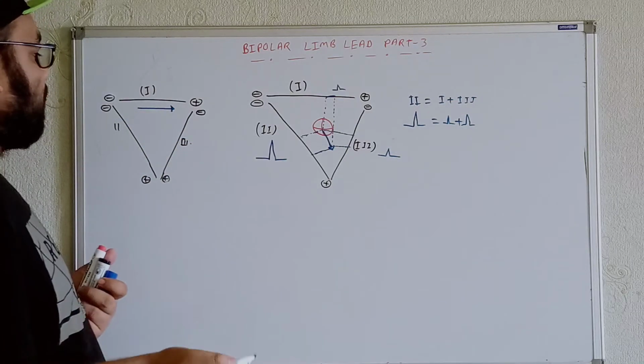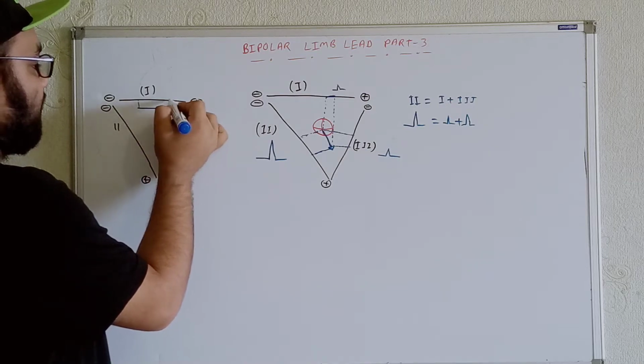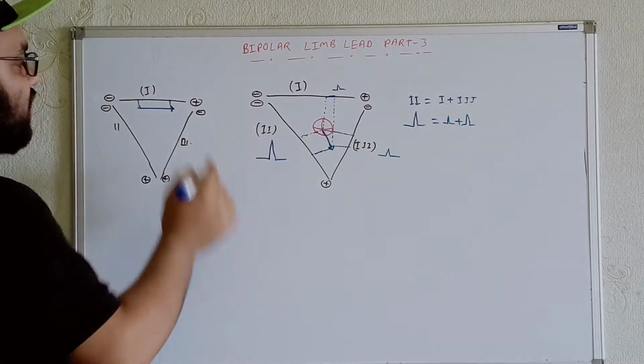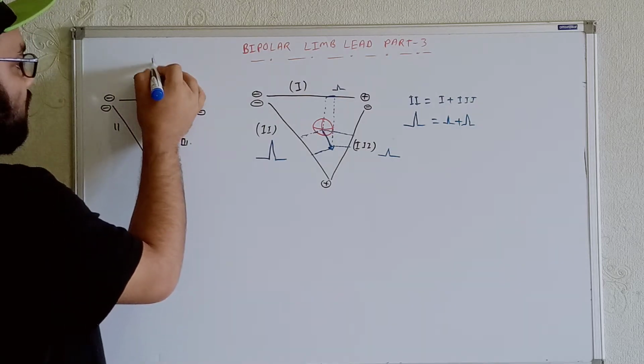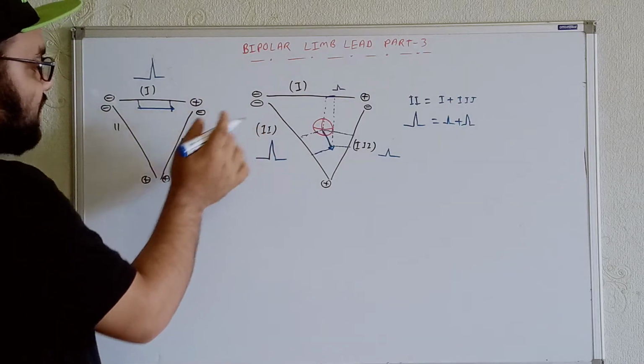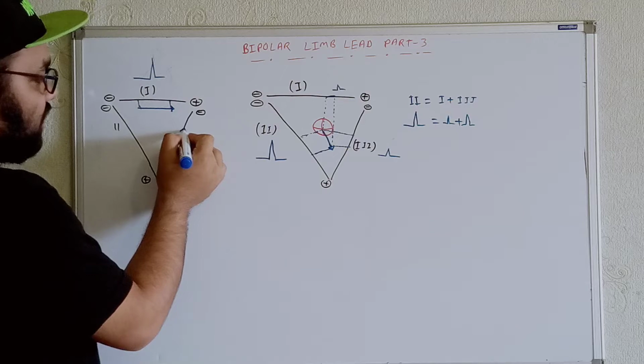As a result, what do we know? Definitely the first lead will have much more of the perpendicular area with respect to this one. So definitely the fluctuations in lead number 1 will be much more over here. Now we have the direction in this direction. So the direction of the vector for lead number 3 will be changed right now. It will be in this direction.